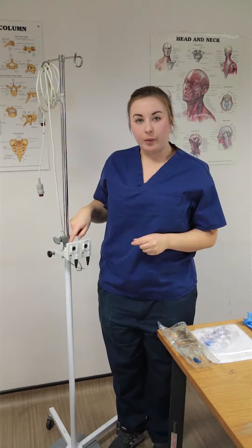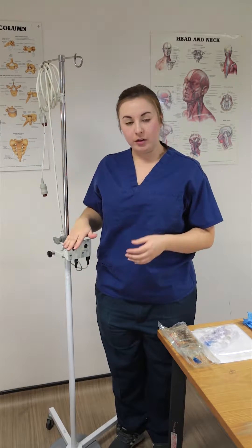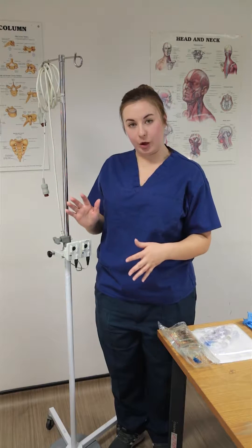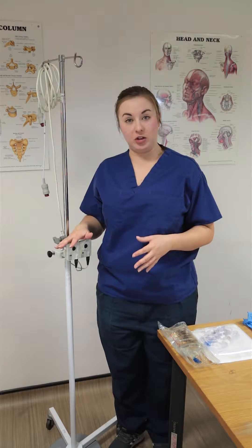The key thing to remember with your transducer kit set is that it needs to be at heart level. So look at what height your patient is at — if they're on a trolley, are they sat up slightly or laid down — and also adjust the height dependent on how your patient is positioned.